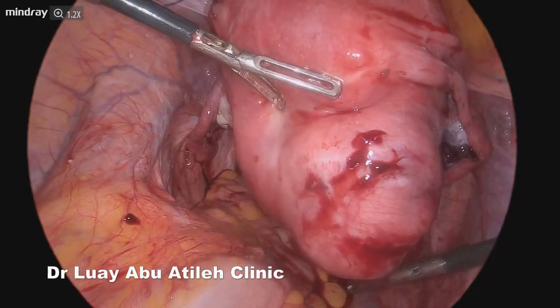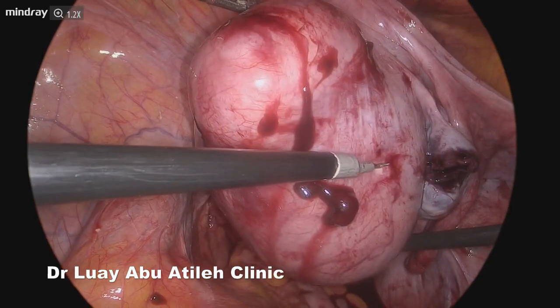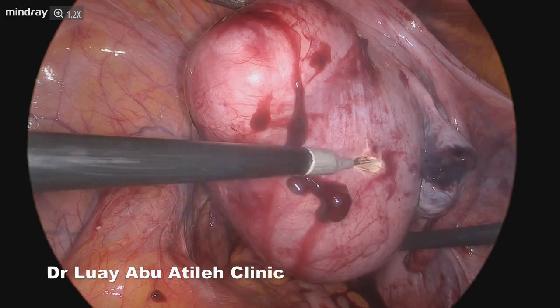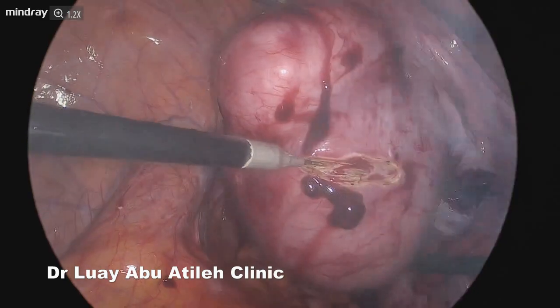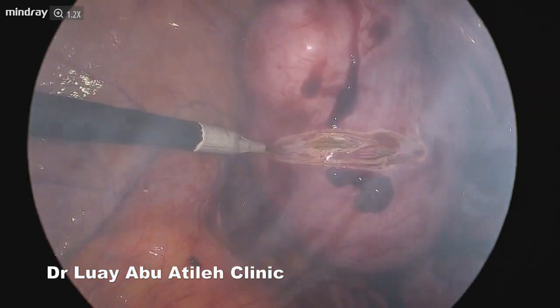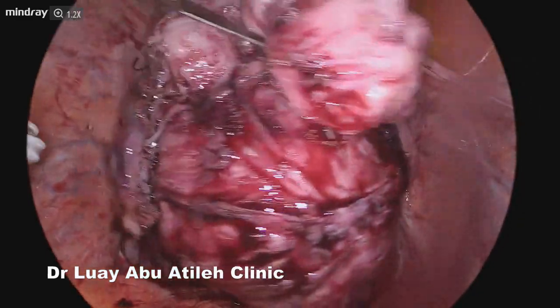We will notice during the surgery how blood loss is decreased. The color of the uterus becomes whiter, and this is causing no harm to the uterus. After we finish the surgery, all we need is to cut the thread of the tourniquet and the blood will return to the uterus.